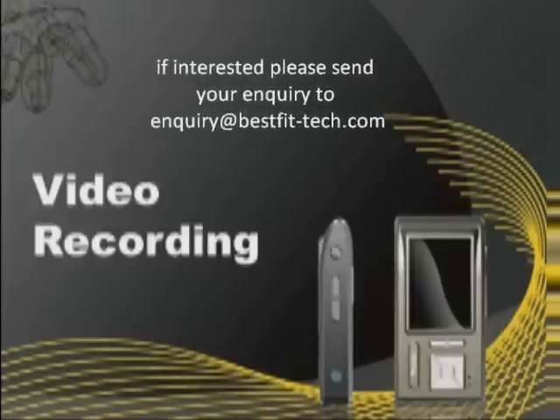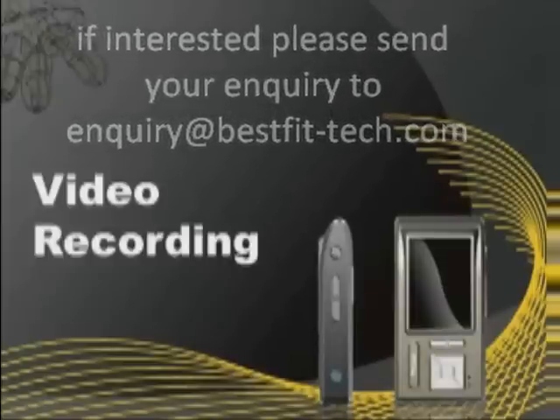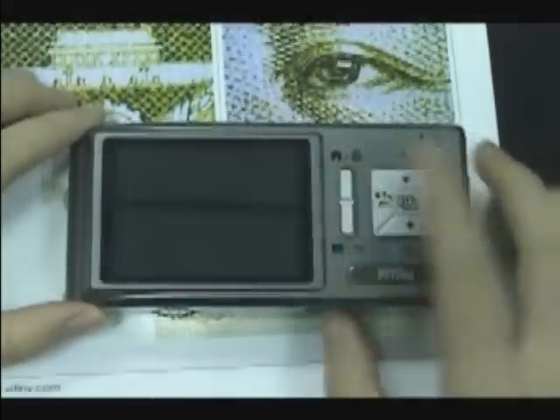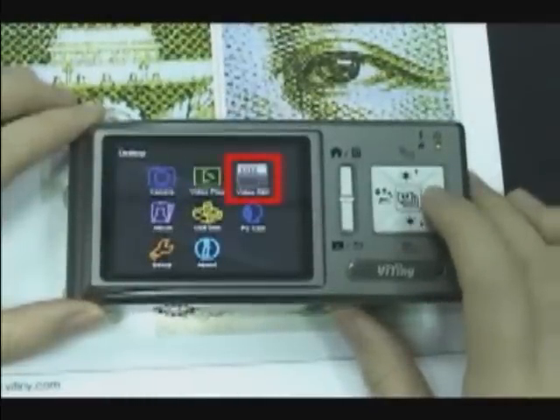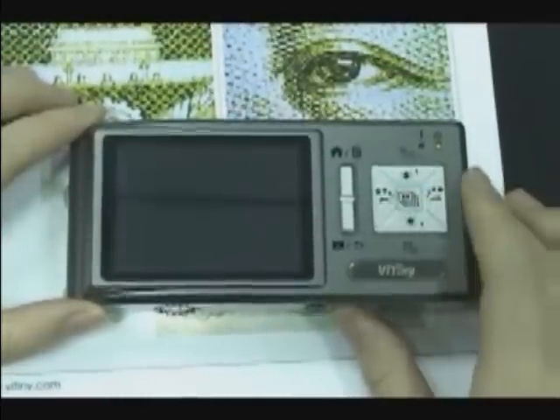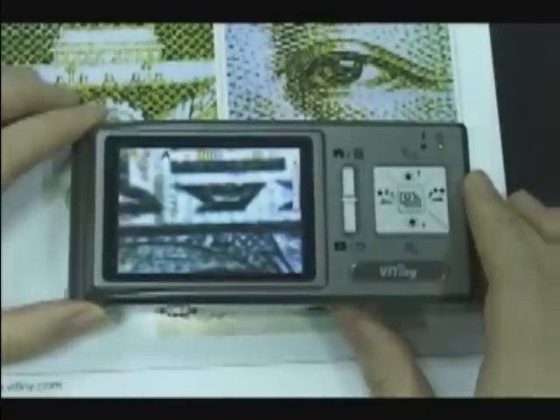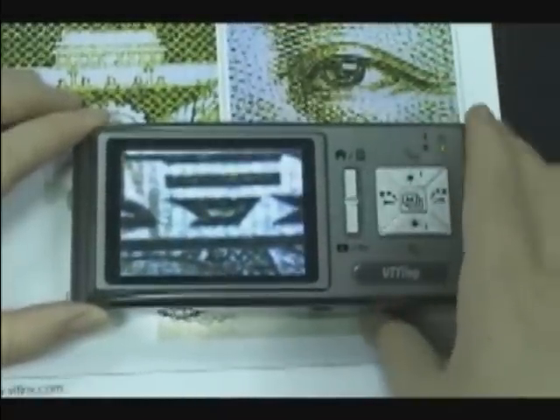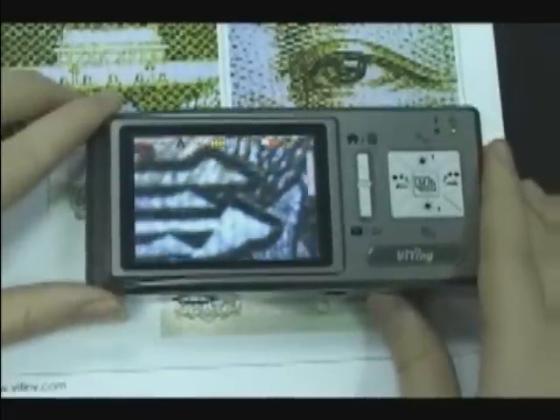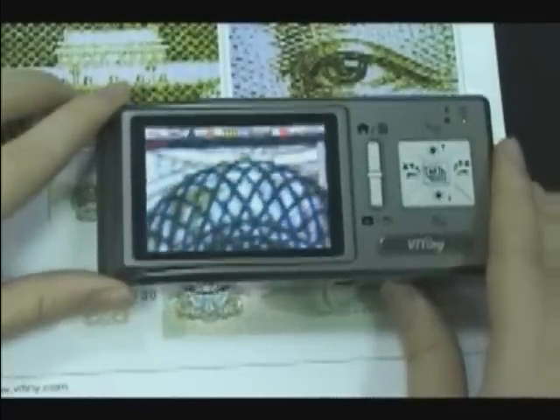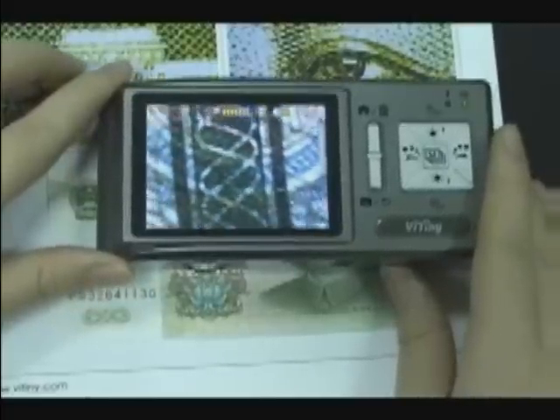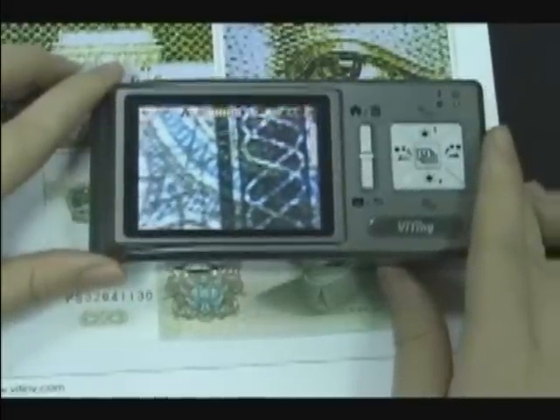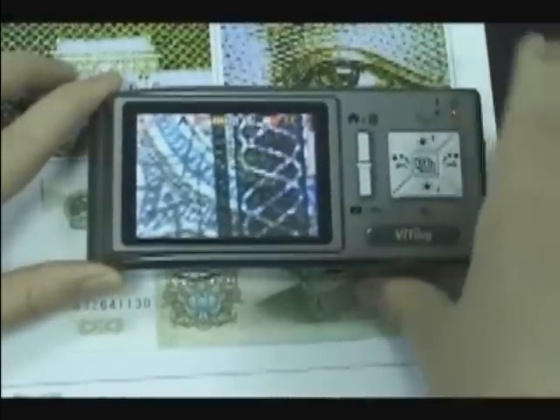Video recording. Press the menu button to enter the menu and choose video record. Press the snapshot button to start recording. Press the snapshot button again to stop recording.